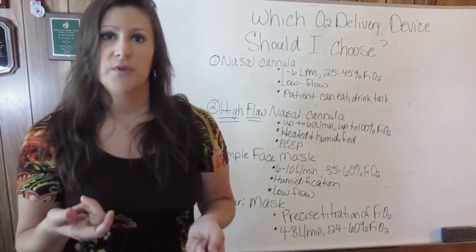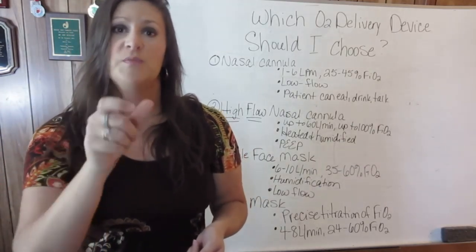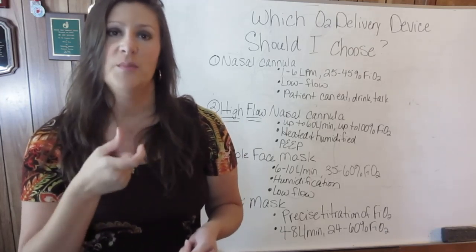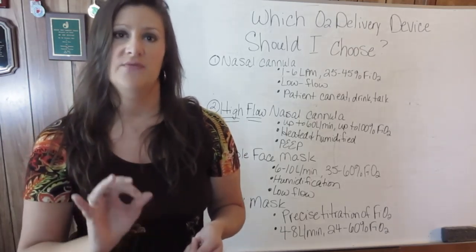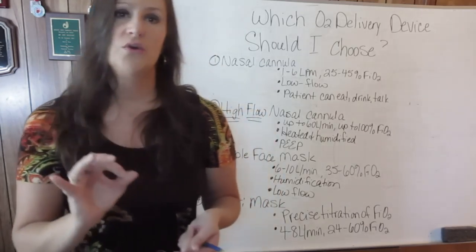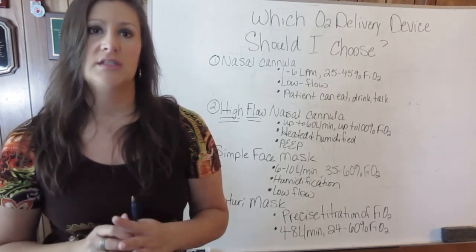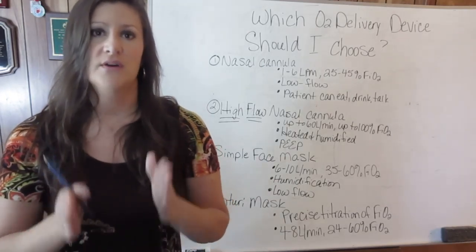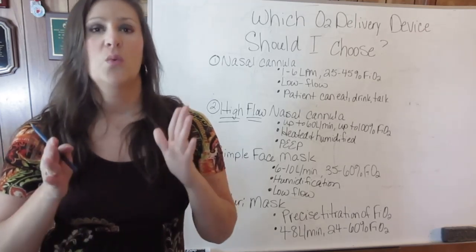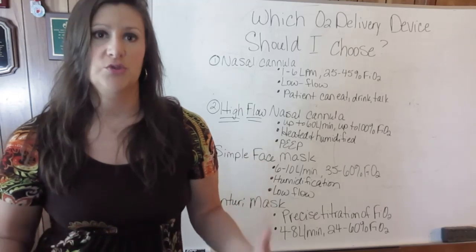Well, I will reach for the little yellow adapter and attach that to the mask, and the patient will get precisely 45% FiO2. So your Venturi mask is wonderful for COPD patients that need a very, very precise amount of FiO2, because we don't want to give them too much to knock out that hypoxic drive.